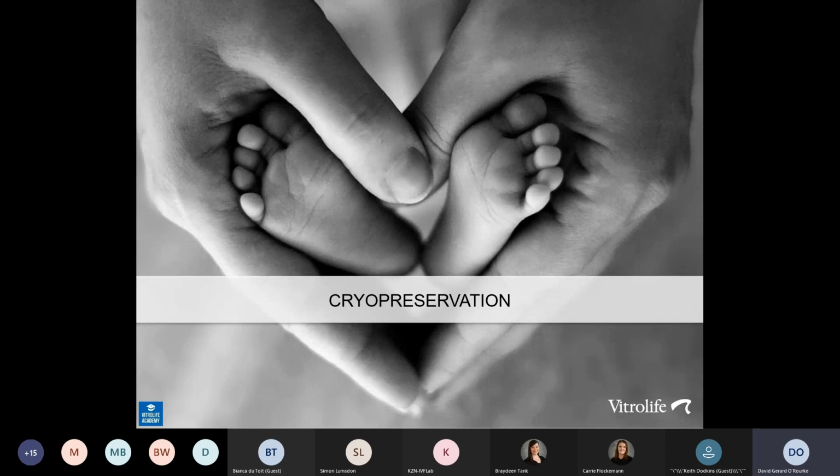Now, due to the movement of biopsy to day 5, we've also taken a big step in terms of our cryopreservation and the technology we use. Traditionally, we would use a slow freezing technique, but more recently we've moved to vitrification, which we have seen to be a lot more reliable. The embryos that are thawed from vitrification are a lot more viable, and the data shows that they lead to higher pregnancy rates.